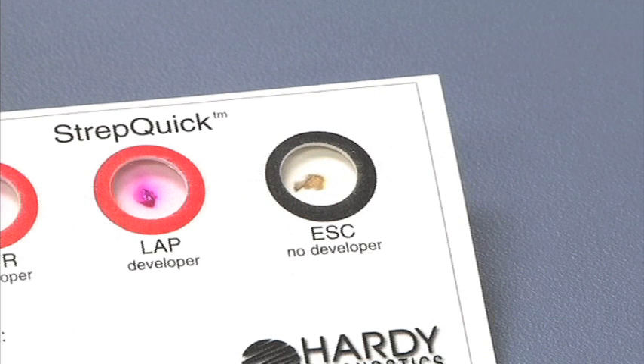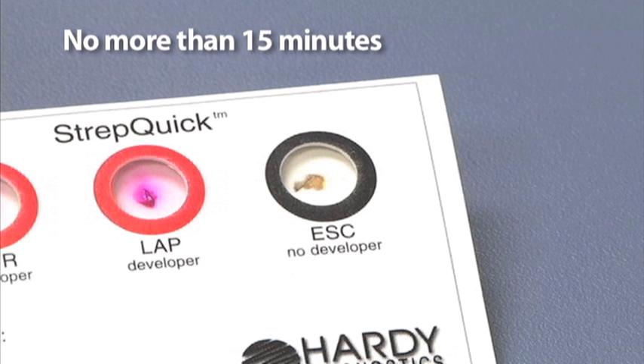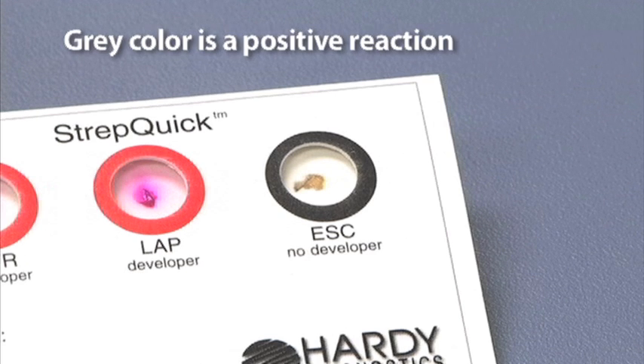For the third circle, which is esculin, observe for any darkening of the reaction by no more than 15 minutes. Any development of a gray color would be considered a positive reaction.